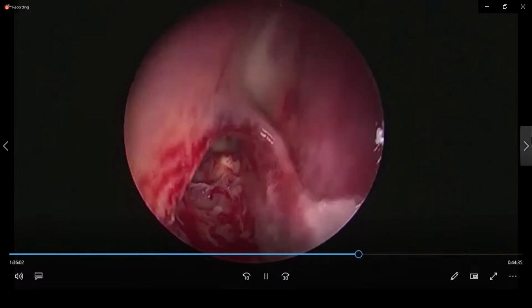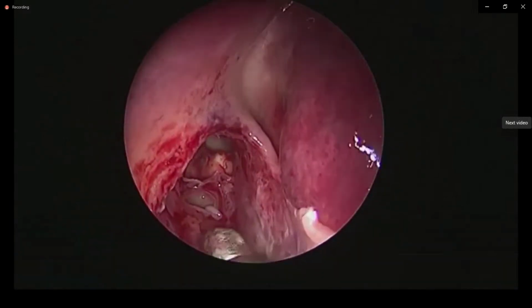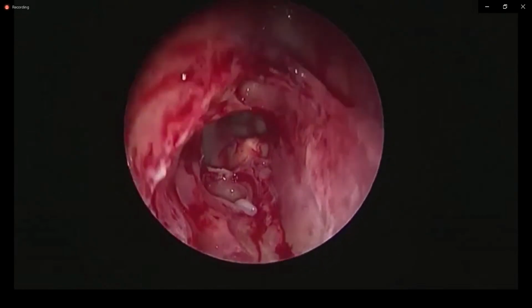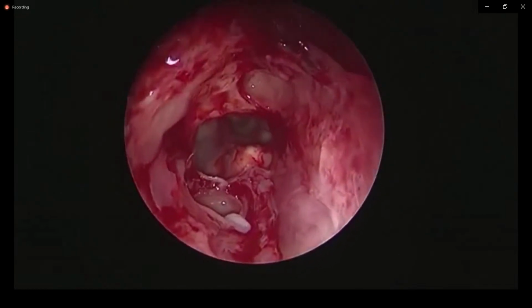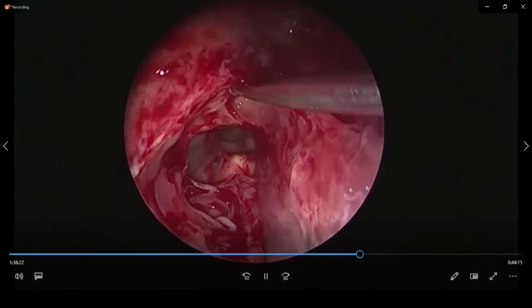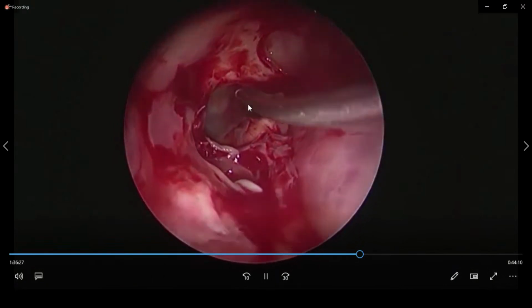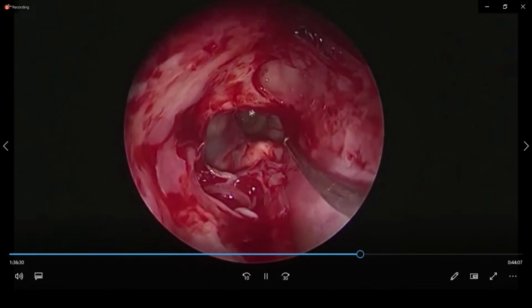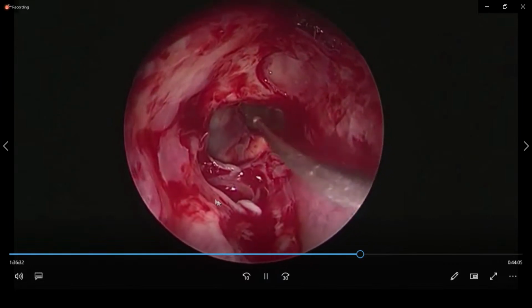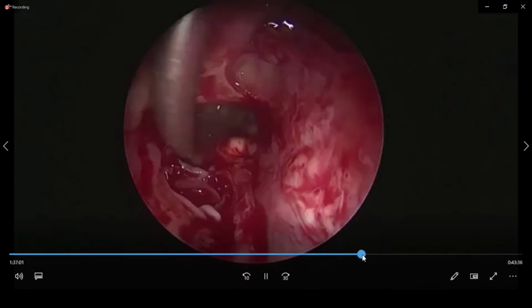See, so many openings now coming into shape. The frontal sinus, the most medial one, being in picture, the type 3, and the supraorbital cell being lateral, all narrowing the frontal sinus outflow, complicating the frontal sinus anatomy. This is the beak. Beak is the anteriormost anatomy, that's the anteriormost limit. The frontal sinus is medially here, and this cell is the supraorbital cell.